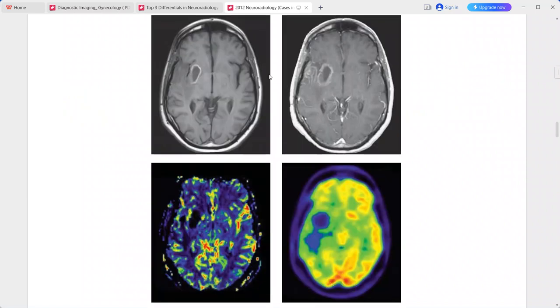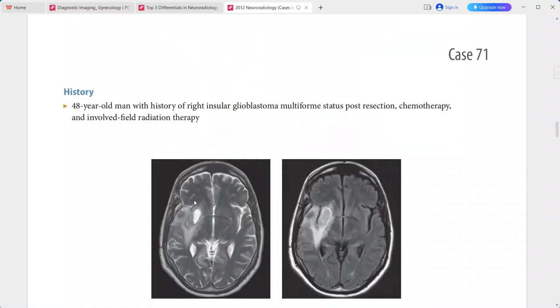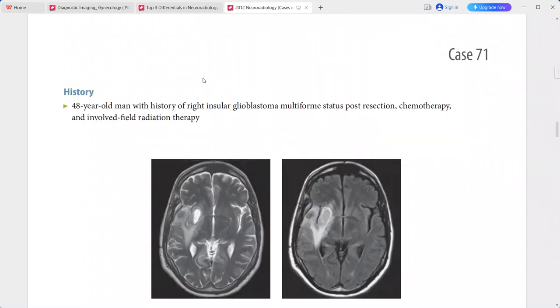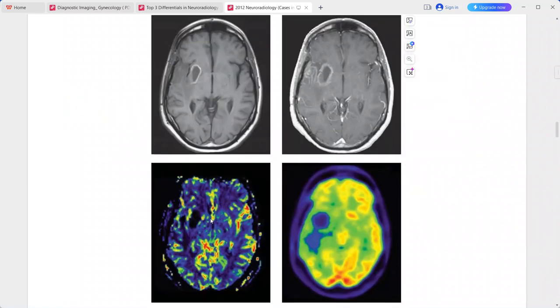There is irregular enhancement in this region on post-contrast sequences. The resection cavity has a rim that is hyperintense on both T2 and T1 sequences. This hyperintense rim on T1 and T2 is quite consistent with the presence of blood products.